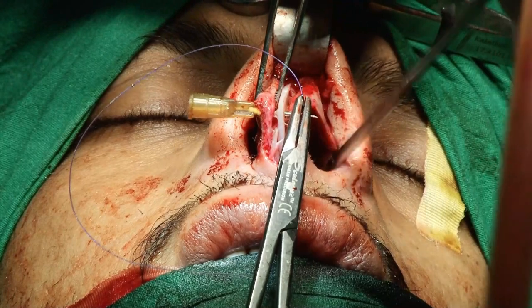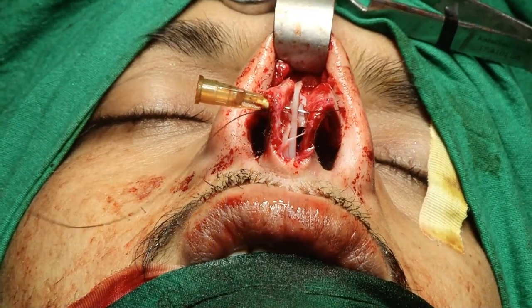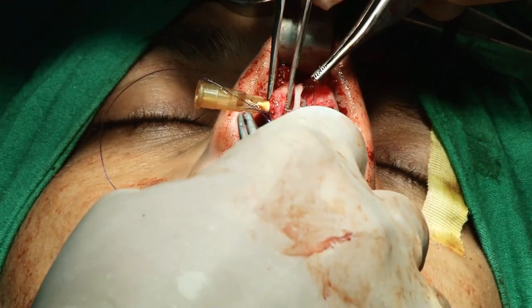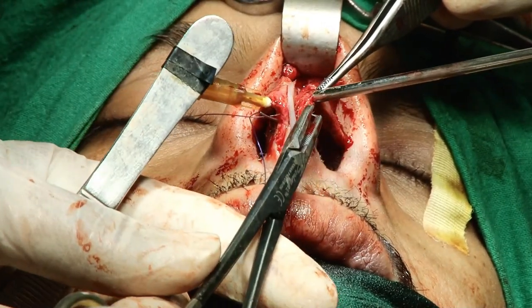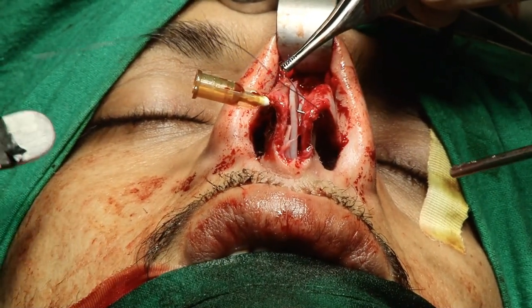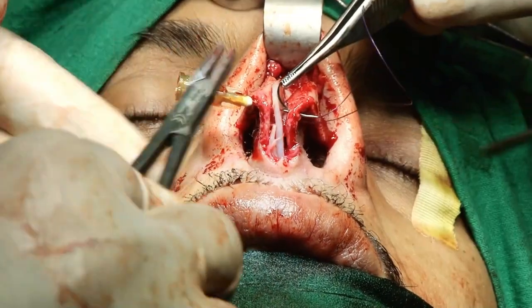When you advance the medial crura on the native septum and suture it with the septocolumellar suture, that is the tongue-in-groove. But sometimes, like in this case, you have a defective, deficient native caudal septum. In that case, first you reconstruct with a septal extension graft or septum replacement graft, and then you advance the medial crura onto that part of the septum. That is the modified tongue-in-groove.